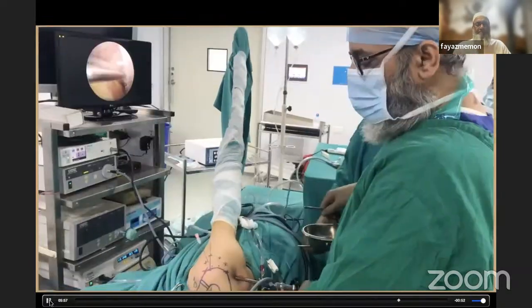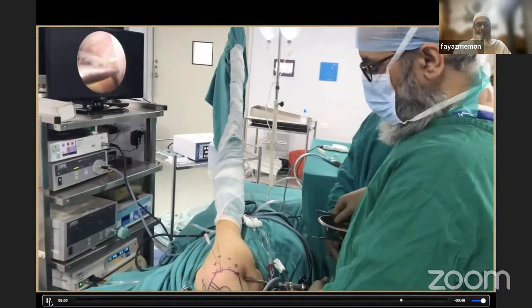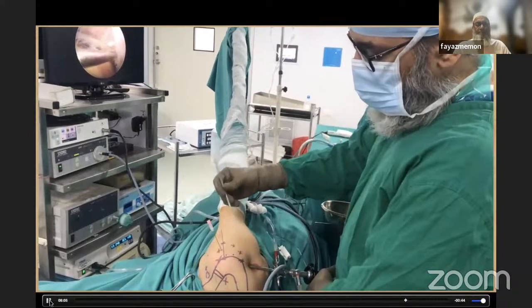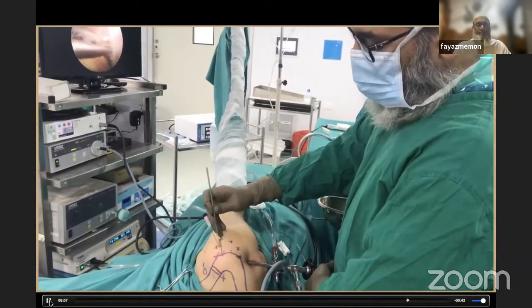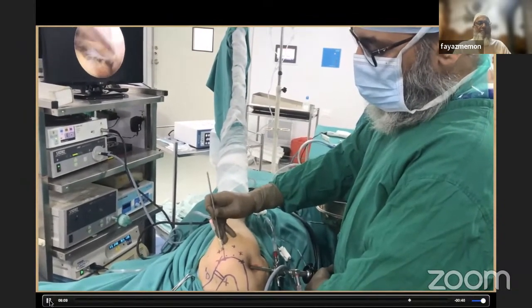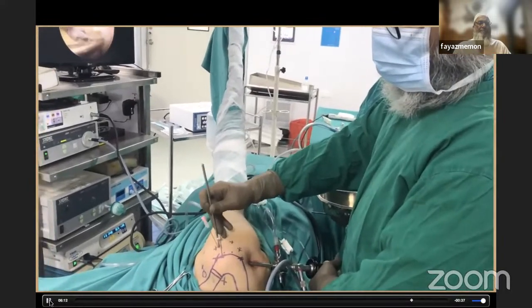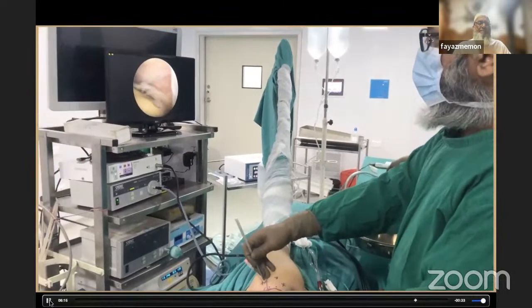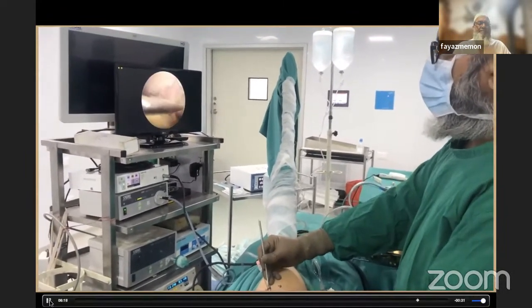One thing that you must remember in case of a shoulder joint is do not remove the needle that you put. First, take the incision exactly along the line of the needle insertion and see that the tip of your incision has come out inside the joint here. And then you remove your needle.